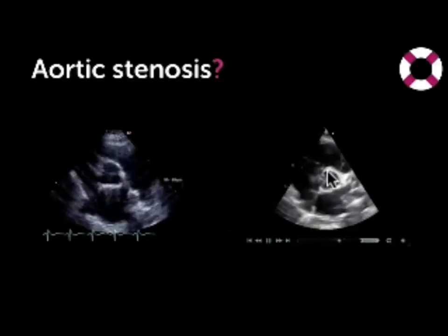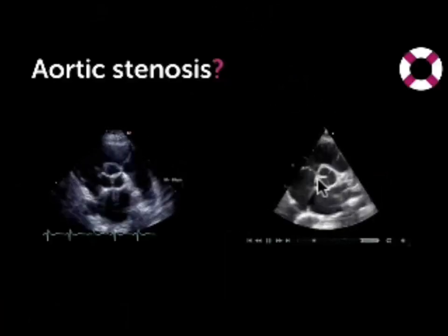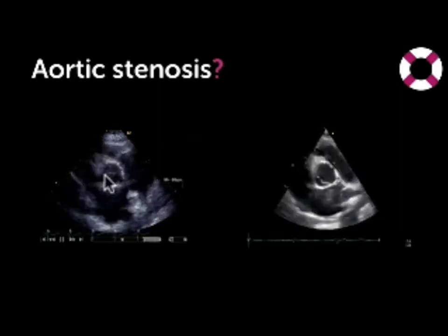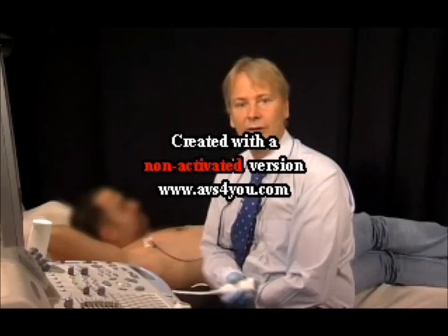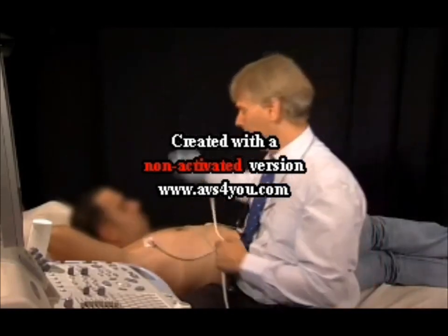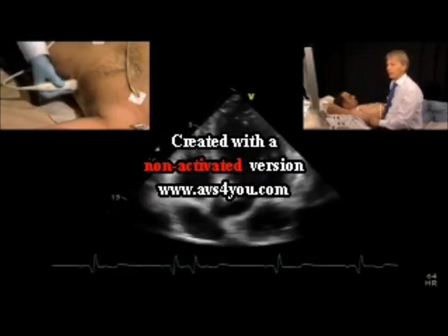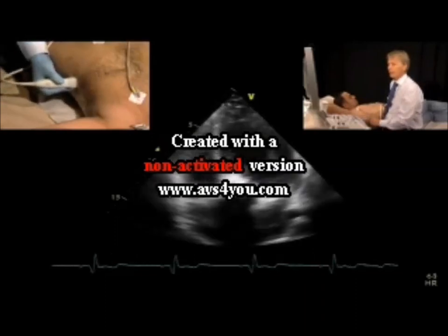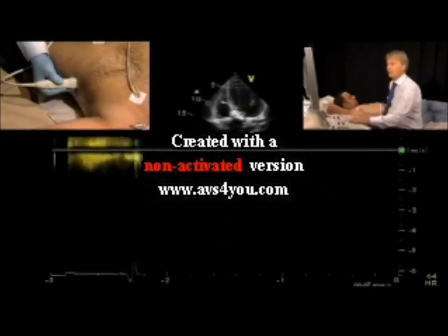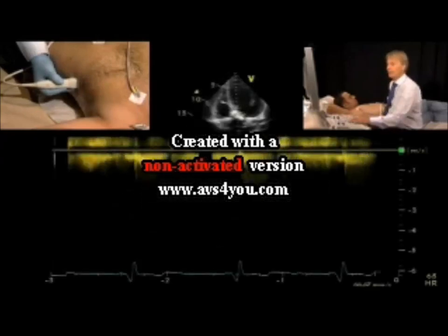In the normal patient, we have almost complete opening where the cusps almost touch the aortic root, while this is not the case here. To quantify aortic stenosis with CW Doppler, I would start from the apical approach, and I would try to get an apical 5-chamber view and place the continuous wave Doppler spectrum right inside the valve.